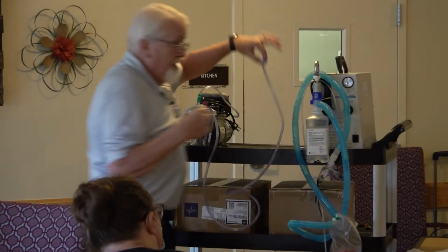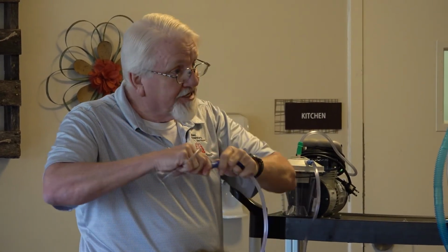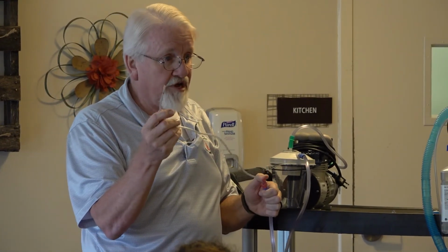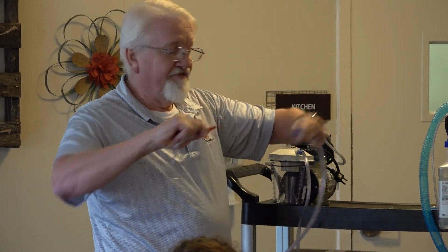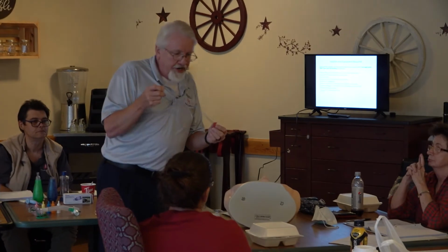My hand is going to stay sterile because it's the one I'm going to use to insert. So what I'll do is hook up. This hand's dirty now. I just picked up the tubing. This is my dirty hand, and I make the connection. My right hand is the only thing that can touch that tube now. Because our cord is not 25 feet long, I'm hooked up. This hand's sterile.